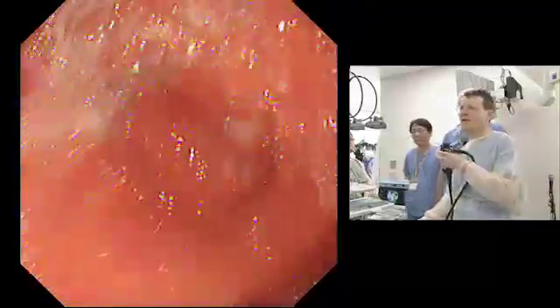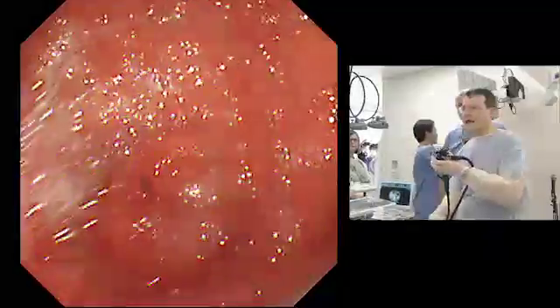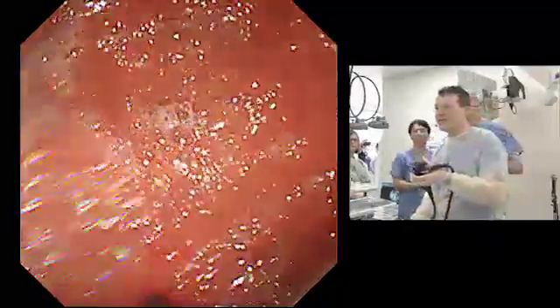So in such a situation where I know that the patient has a pancreatic cancer, the first question for me is always, does the patient have a bulging? And we have introduced the EUS scope here. I'm just in the area of the corpus of the stomach. And now I advance the scope here in the area of the lesser curvature, but we don't see any bulging. And the next point I usually do, I pass into the duodenum.